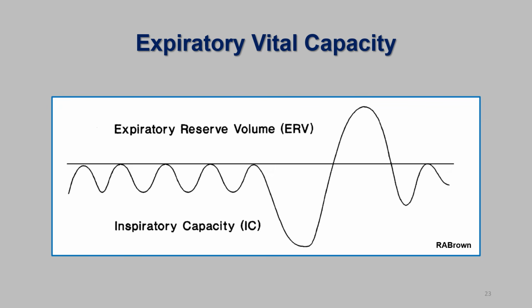Let's take a look at the expiratory vital capacity. After a number of acceptable tidal breaths, again with consistent end expiratory levels, the subject is instructed to maximally inspire to total lung capacity, followed by a passive exhalation to residual volume.